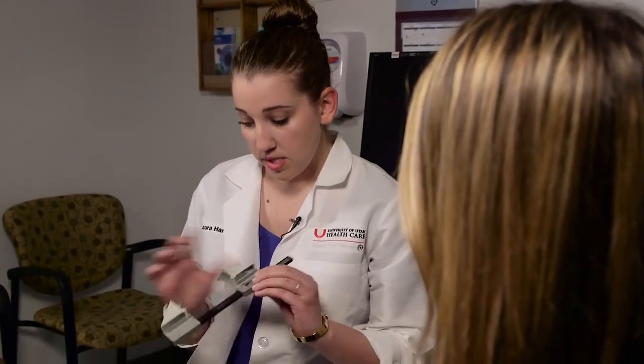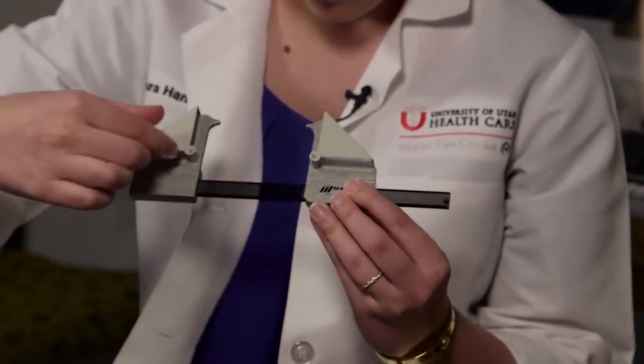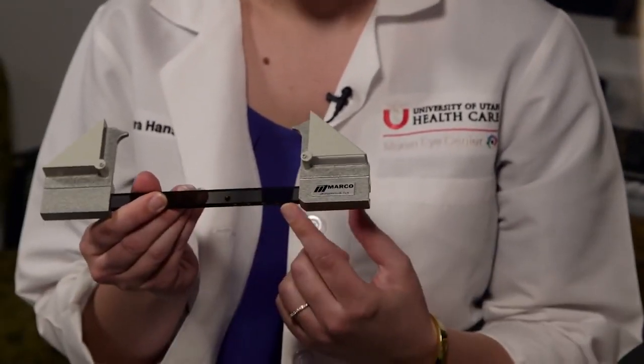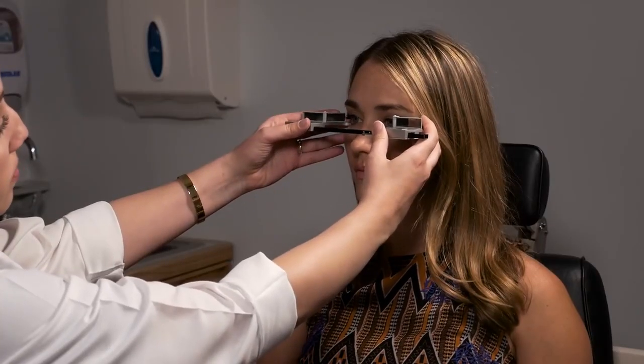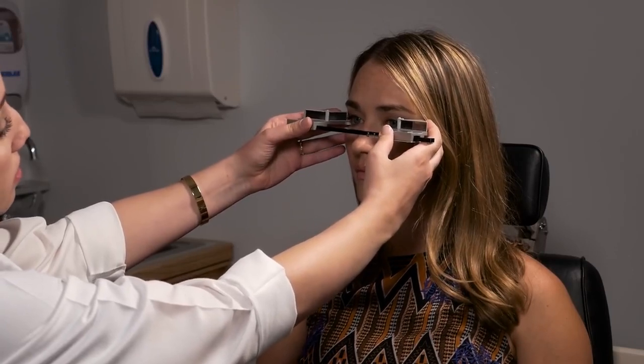Okay. I'm going to show you now how the neuro-ophthalmologists use the Hertel exophthalmometer to measure the position of the globe within the orbit. So this is the Hertel. These are the index points. These are the mirrors. And this is the ruler that you use to measure the base. So what you want to do is take the index points, and we like to put them just inside the temporal orbital rim, just slightly inferiorly to the lateral canthus.